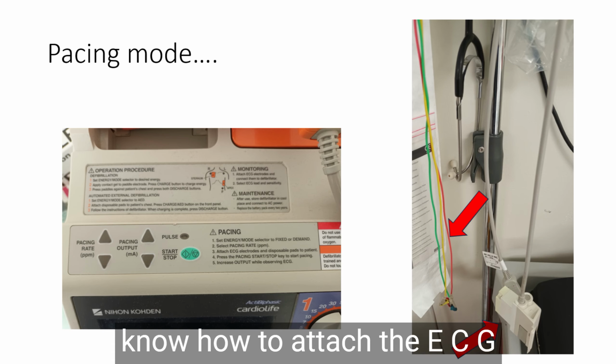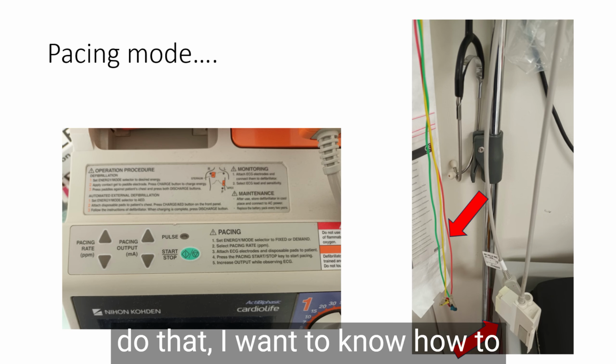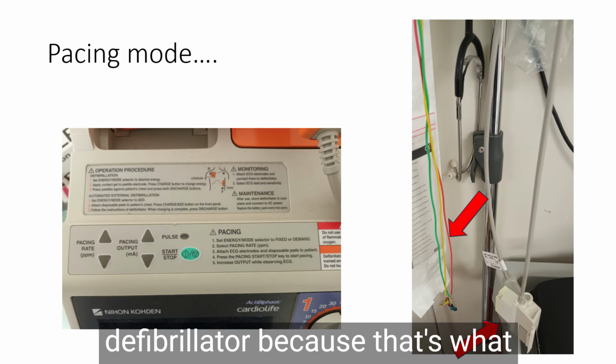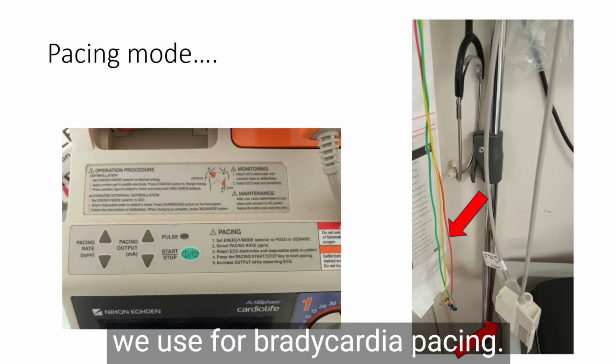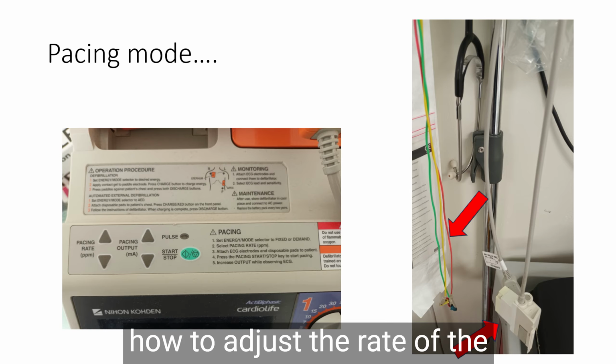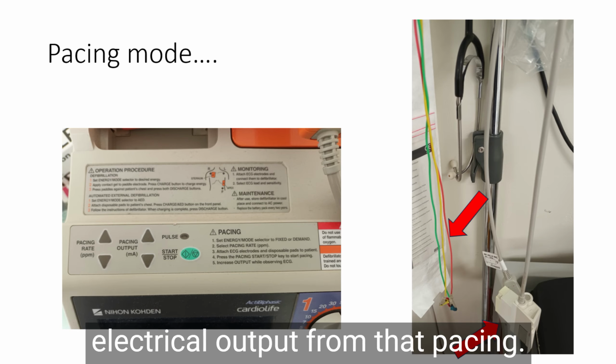I want to know how to attach the ECG electrodes to the defibrillator to do that. I want to know how to attach the AED stickers to the defibrillator, because that's what we use for bradycardia pacing. And then I want to know how to turn on the pacing mode, how to adjust the rate of the pacing, and how to adjust the electrical output from that pacing.